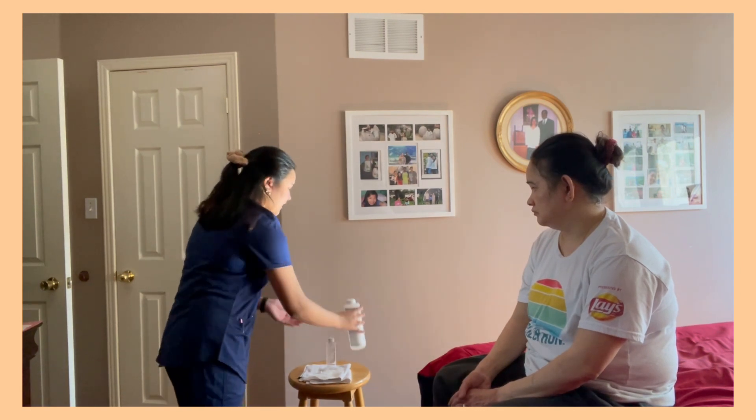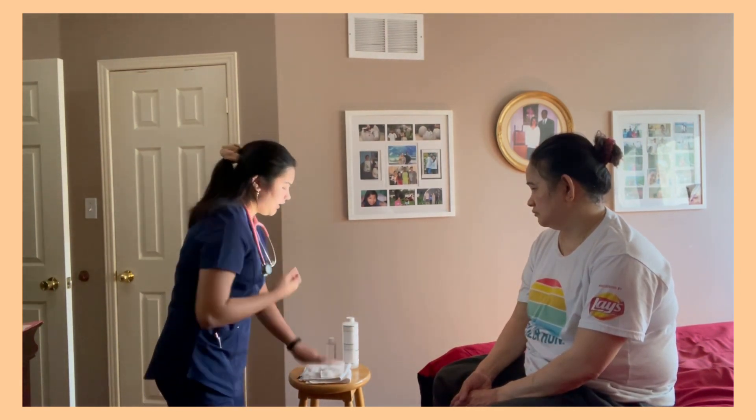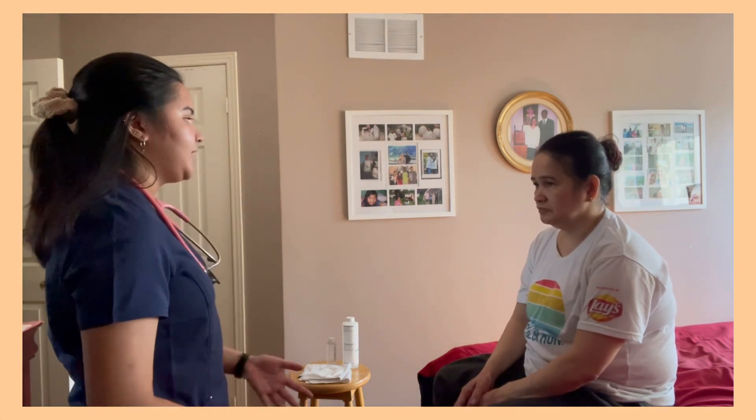I will be washing my hands, sanitizing my stethoscope, and then putting on gloves. Hello, my name is Vanessa. I'll be your student nurse for today. I'm going to be performing an assessment. Is that okay?